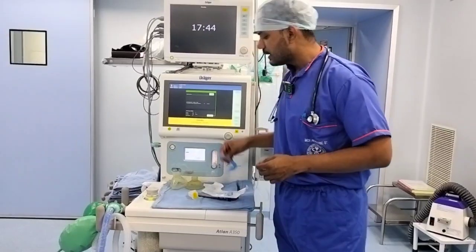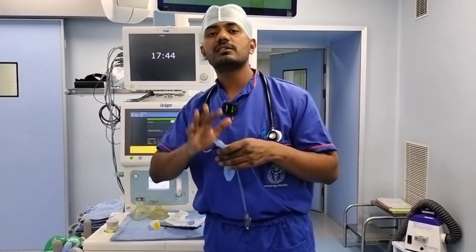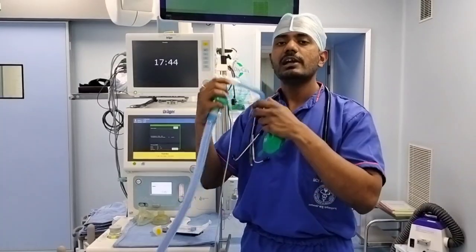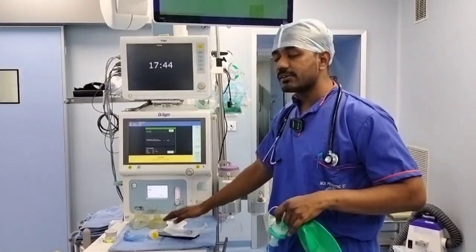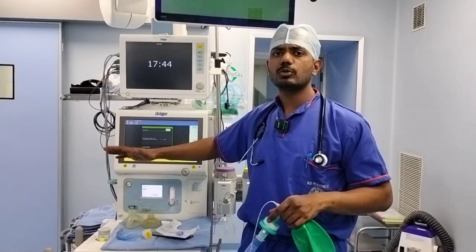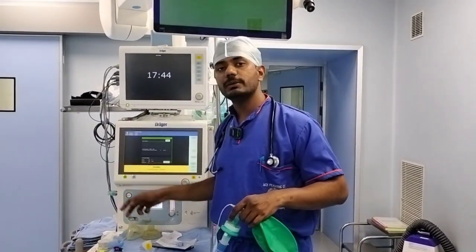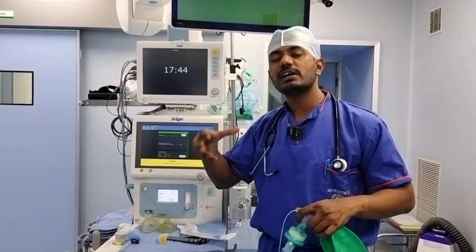To overcome that, they came up with another thing called the supraglottic airway device. This doesn't go into the trachea. It just sits above the vocal cords. We can directly connect it to the ventilator, and it goes into the mouth of the patient like this and ventilates the patient. The significance of this is that the airway device market is worth about $2.2 billion and has a growth rate of about 8%. The ventilator itself is not that big a market, because the airway device is a single-use device for each and every patient, whereas we use the ventilator multiple times. This requires so much skill, for which we have to read so many things.